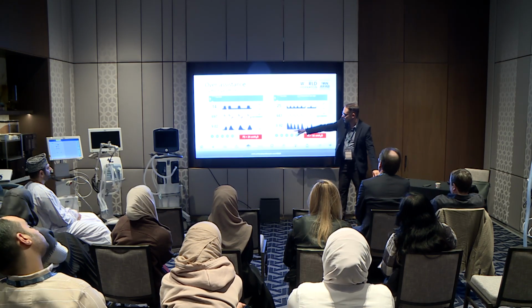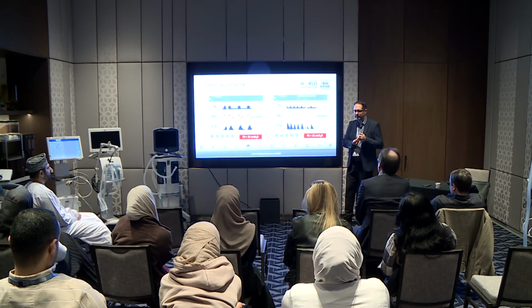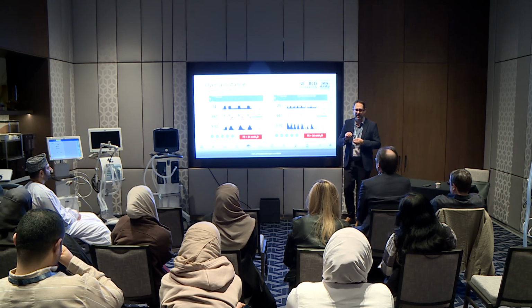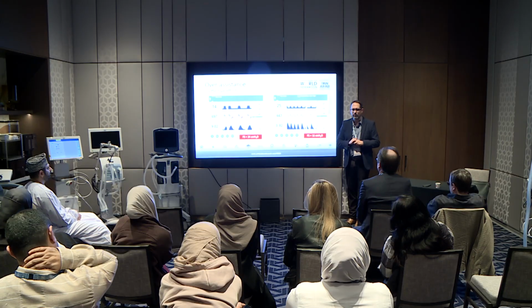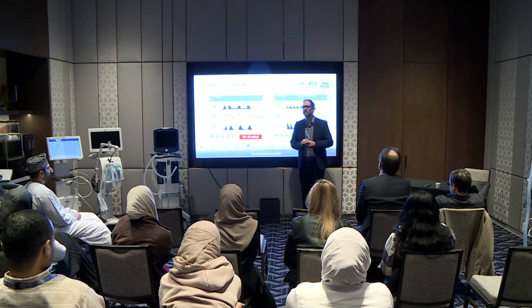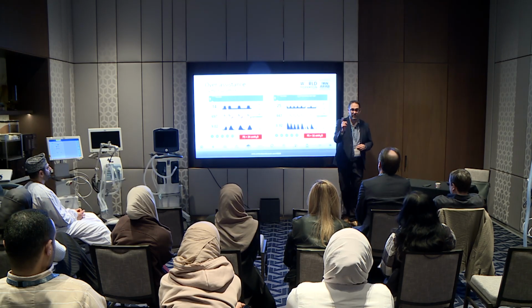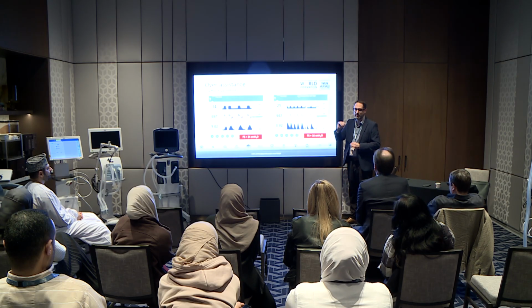So this is pressure support of 24, which is excessive, versus pressure support of 16. So there are 2 things you can look at for where you should definitely assess this. If your respiratory rate is less than 20 on a patient who's intubated recovering from critical illness, that's too low. Wean your patient. Even if you can't recognize this, I used to have students say, how do I know when I should wean my pressure support? I said, if your respiratory rate's less than 20, just wean them. Because chances are, if your rate's 14, you probably have ineffective efforts. Anyone here, if I intubated you and put you on a ventilator, I doubt you'd be breathing that comfortably.